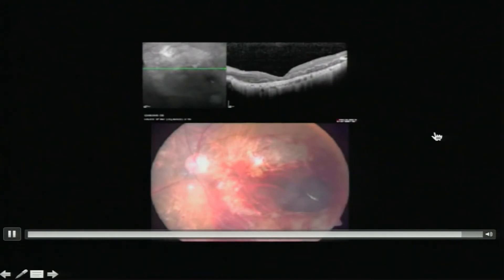The peripheral retina is trimmed with the cutter. Once done, fold it and you can find the membrane under the retina — fortunately the RPE was not ripped during removal. The membrane is quite dense; sometimes difficult to remove with the cutter, so it must be trimmed carefully. This is the post-op OCT and fundus picture of that patient.